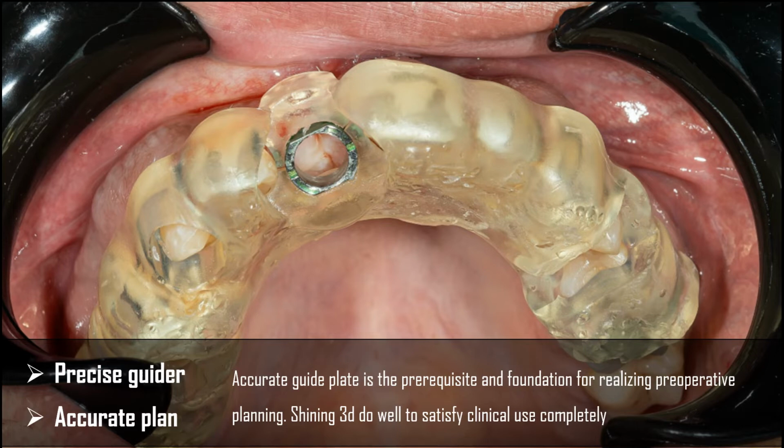Therefore, it is necessary to control the distance between the implant and the natural root surface, as well as between implants, and the thickness of the labial maxillary bone plate. An accurate guide plate is a prerequisite and foundation to realize the pre-operative planning. Shining 3D does well in this, which can satisfy clinical use completely. The guide plate fits well.